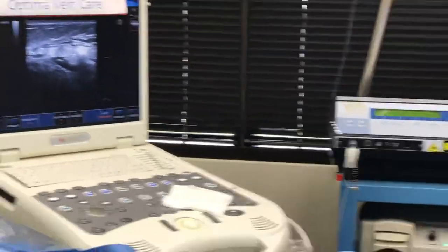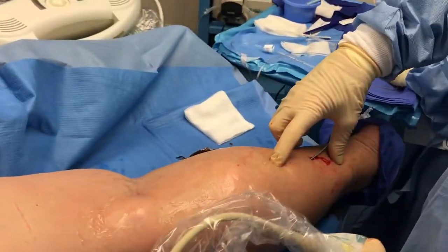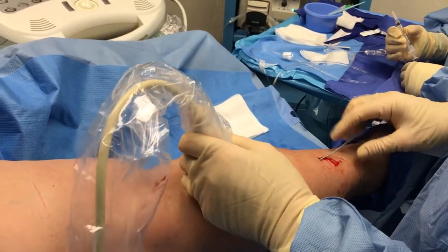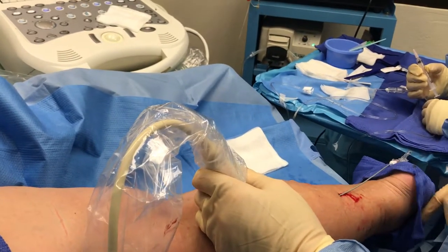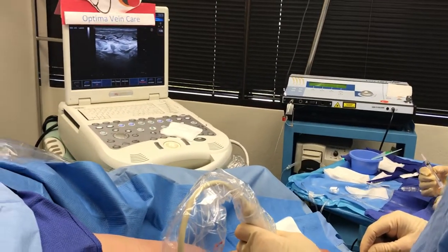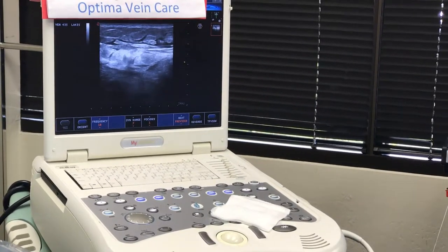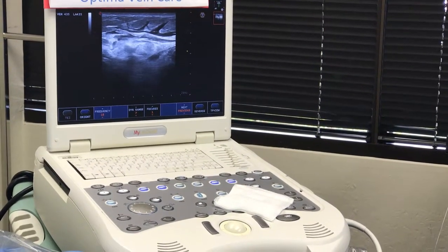The sural nerve is at about this position and it's been heated here, so I tend to ease up on the heat. The sural nerve supplies sensation to the lateral aspect of the heel and ankle foot, and there's been a real problem treating it for any reason.